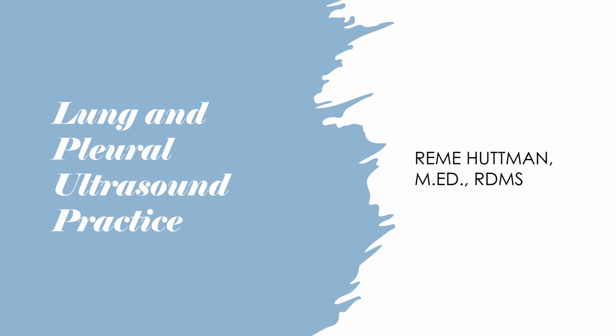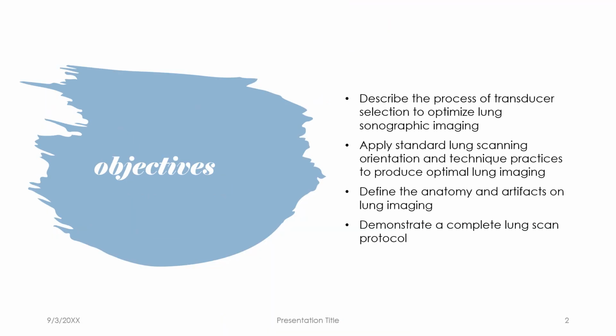Hi, thank you for joining us for our second lecture in our second session of our point of care ultrasound series. And today we're going to look at lung and pleural ultrasound in practice. So hopefully this will become an area that is going to be helpful for a lot of our physicians and practitioners out in the emergency room or even in the acute care setting.